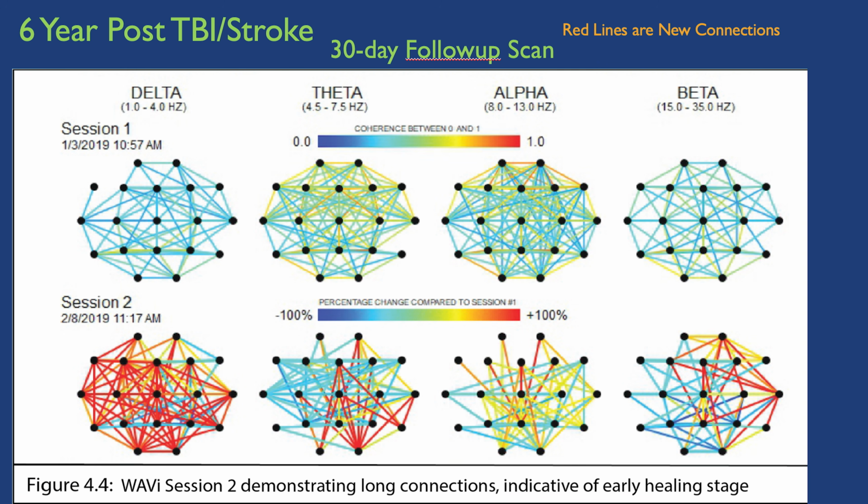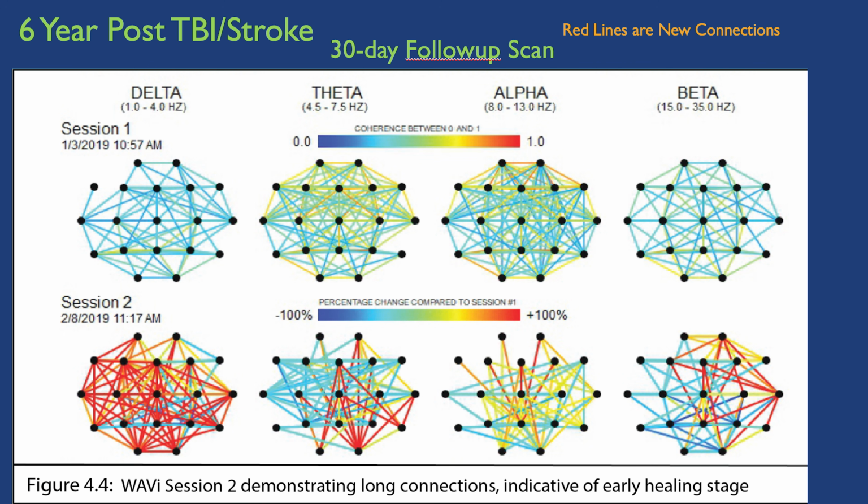That signifies axonal reconnection, because any kind of traumatic brain injury, there's axonal disruptions you can't see. You can see holes in the brain from strokes and stuff on scans, but you can't see the axonal disconnect. And so what this is telling us is that the body is trying to sprout new axons from this left side that was completely disrupted.